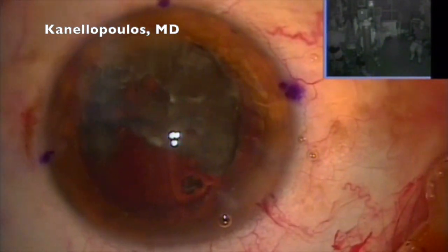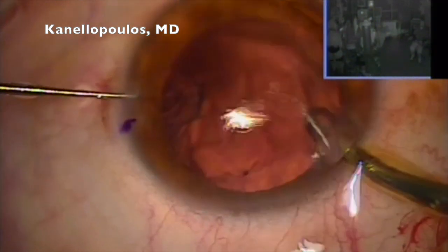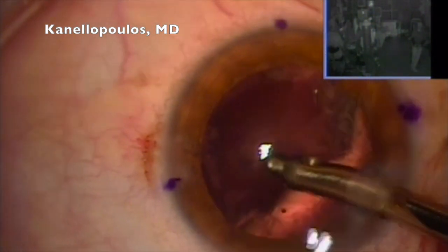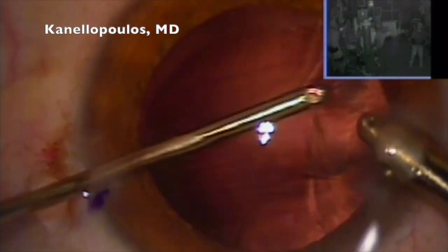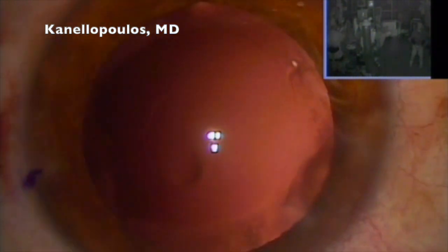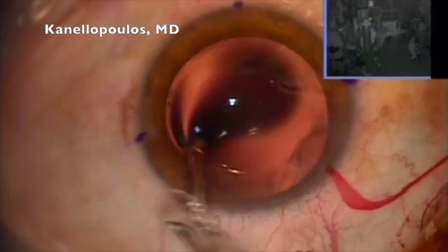So again, same technique. I'm always breaking to put in viscoelastic. Very important point, because once you're left with small pieces of the nucleus, you can easily grasp the posterior capsule and have it rent. And there's no reason to do this. It takes only a few seconds to go in and refresh the visco, and we're always very non-frugal with that, because we like the cornea safety that it gives us. Methylcellulose, fill the bag. Toric lens, we aim to a minus 1/2 on this patient.